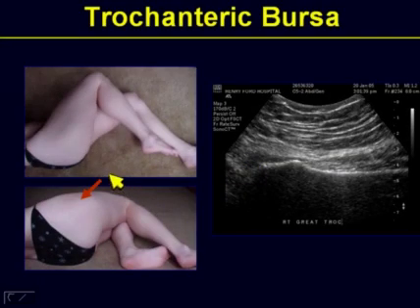So in a patient in decubitus position, very simply, line up the transducer, identify the silhouette of not only the greater trochanter, but also a part of the lateral acetabulum, or if you wish, the ilium.